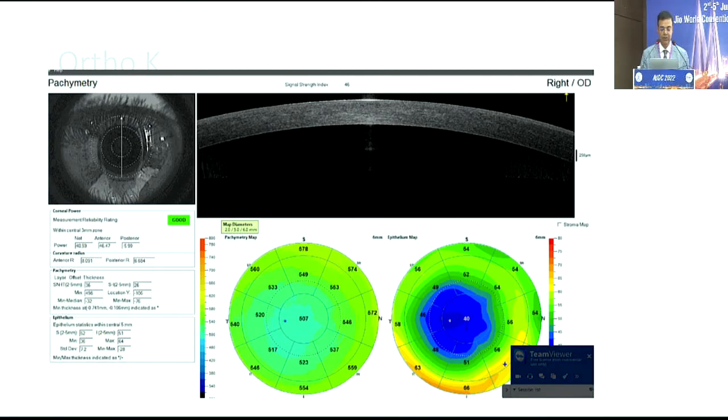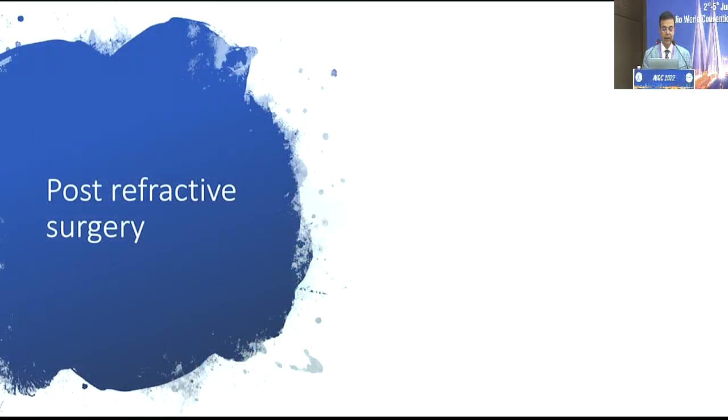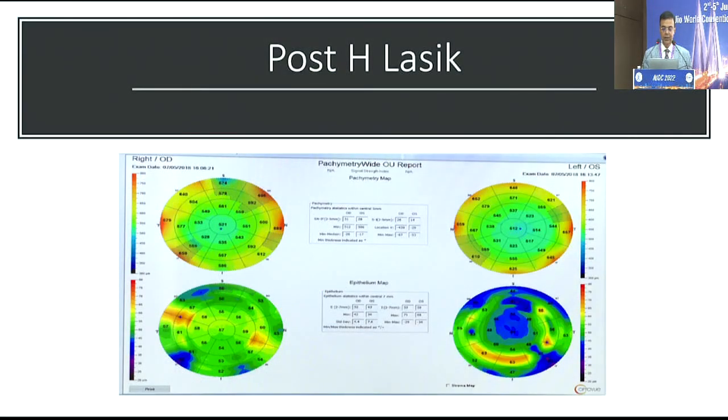Now, this is another patient with a central orthokeratology-induced epithelial thinning, and post refractive surgery, as I said, post hyperopic LASIK, the change will be totally different. And in fact, sometimes if you are suspicious of somebody having undergone a refractive surgery, a good idea, especially if somebody has refractive surgery for small errors and is not being picked up very clearly on topography or on Pentacam, the epithelium maps will give it away, and you will see the difference in the epithelium thickness mapping. So if you're not sure whether somebody has given you a correct history of refractive surgery or not, this can again be a very useful tool in picking up as well.